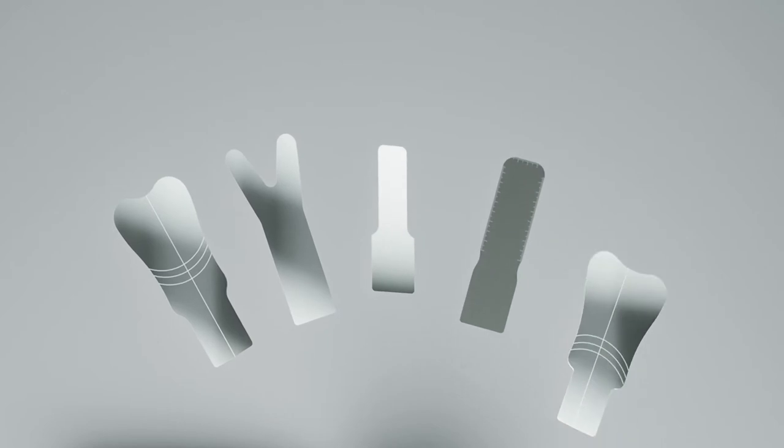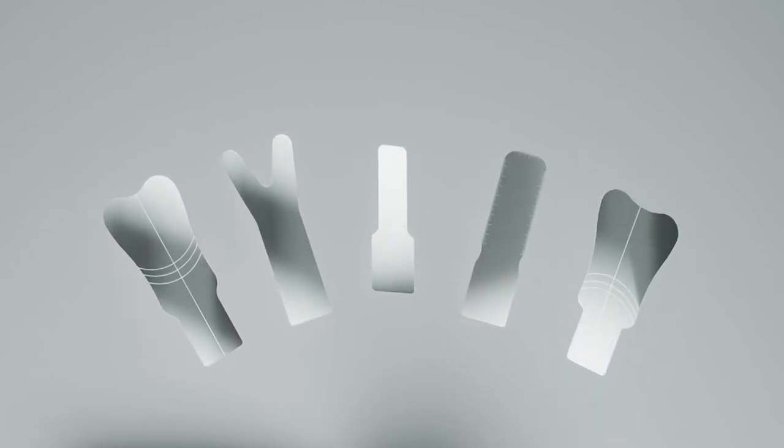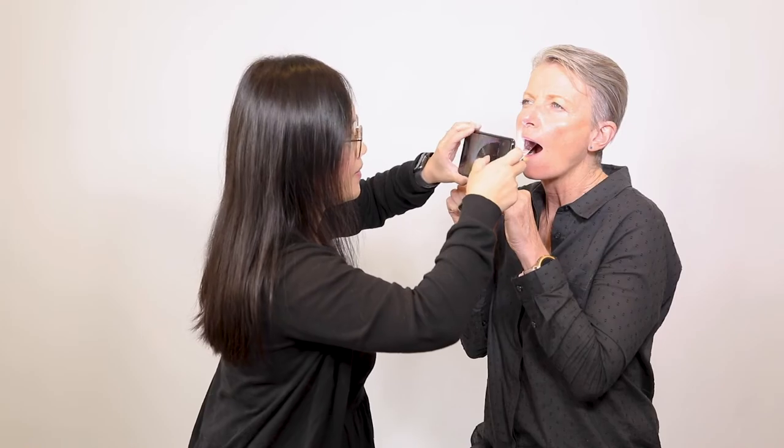The Demystify Kit has a series of five mirrors that can be attached to the ALD unit for image capture, designed for all mouth sizes and shapes, to capture bites and for quantifying distances in the oral environment.